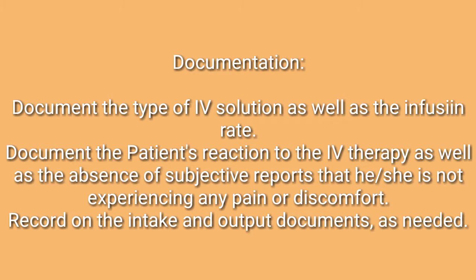Document the patient's reaction to the IV therapy, as well as the absence of subjective reports, that is, that the patient is not experiencing any pain or discomfort. Record on the intake and output document as needed.